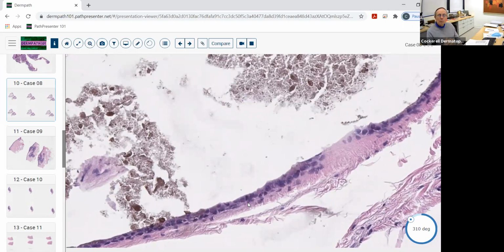Do we really know 100% for sure that it might not be a little apocrine hydrocystoma that just doesn't have a lot of apocrine snouting to it? Well, no, we really don't. But when you see these very tiny, thin layers like this, they get called an eccrine hydrocystoma, and I think that's reasonable. I don't like to fight about these.